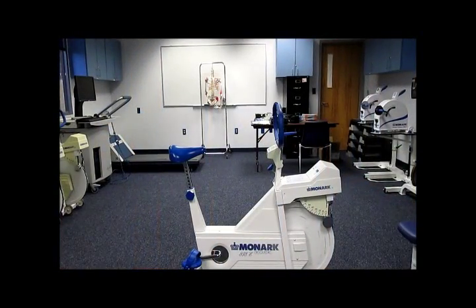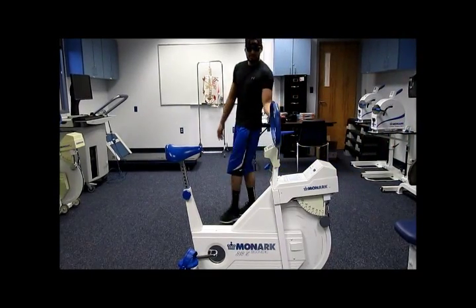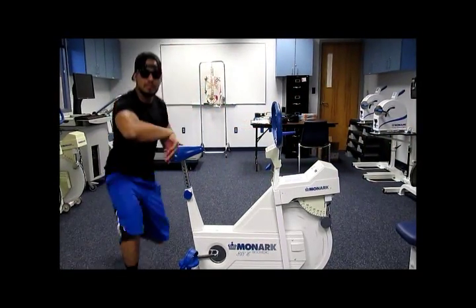The final piece of equipment Johnny will be modeling for us is the Monarch bike itself. We will use a Monarch bike because you can set resistance to it for the different stages.